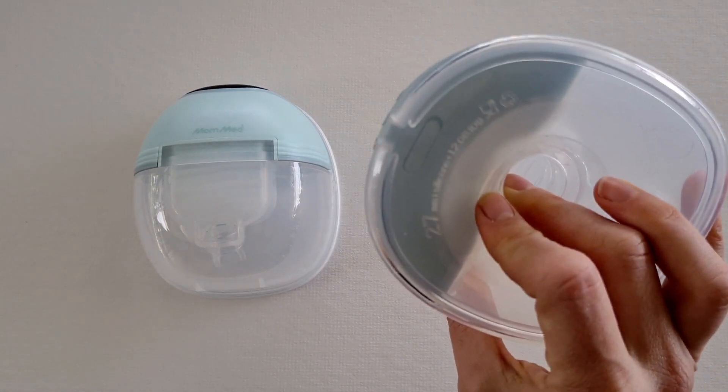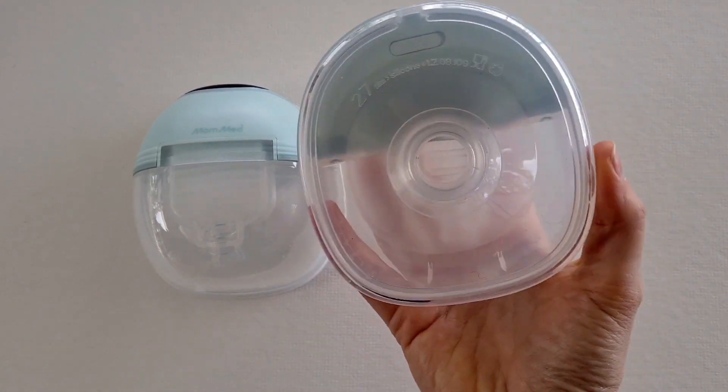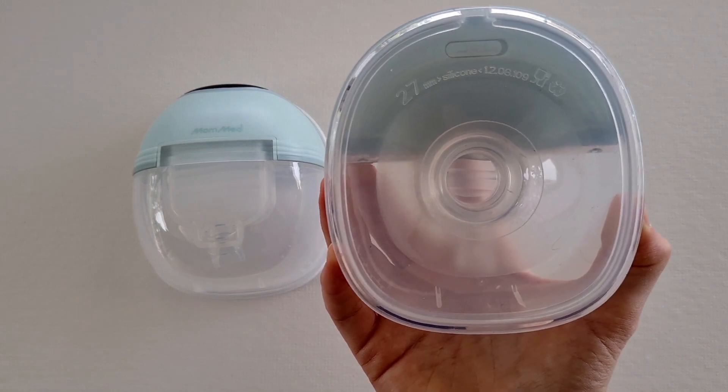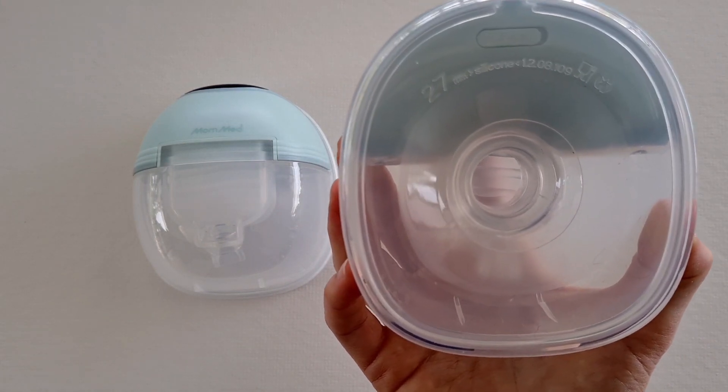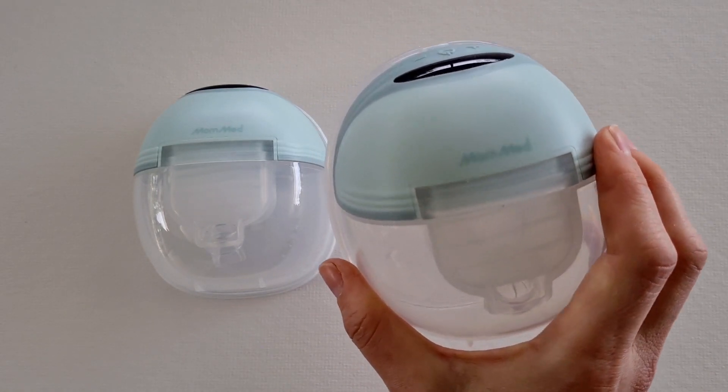All the parts are dishwasher safe, so it makes cleaning really easy. You can see there are no tubes — it's a closed system, which again really helps for maintaining hygiene and keeping your pump easy to clean.